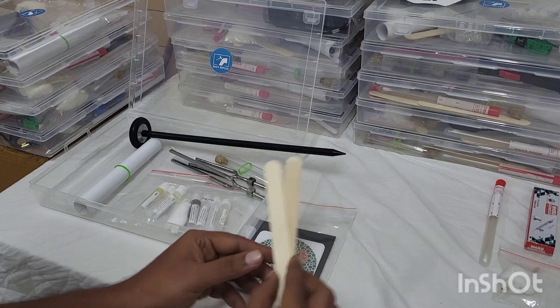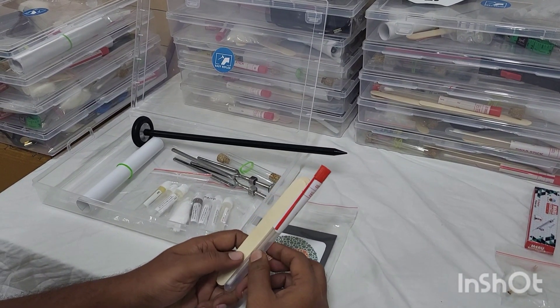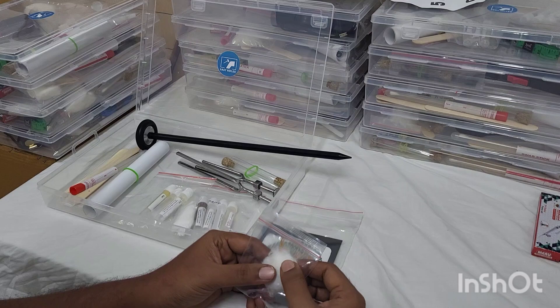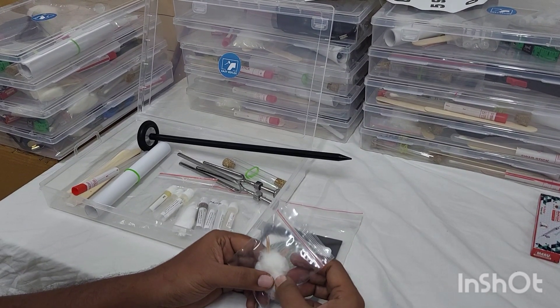Next we have your tongue depressor, which is a use-and-throw one, and a swab stick for 9th and 10th cranial nerve testing for gag reflex. Next we have cotton and toothpick for pain testing as well as fine touch testing.